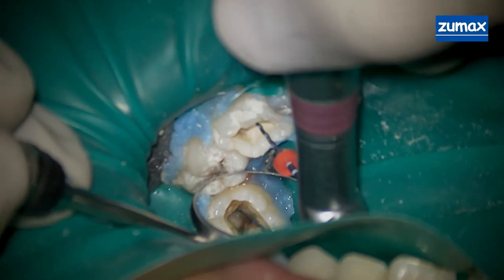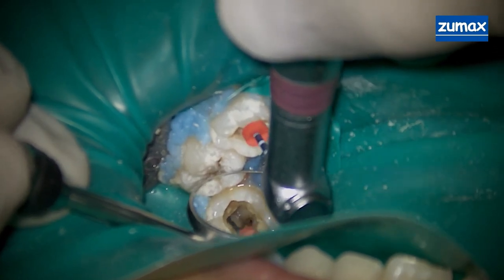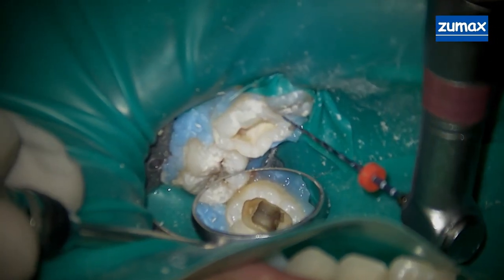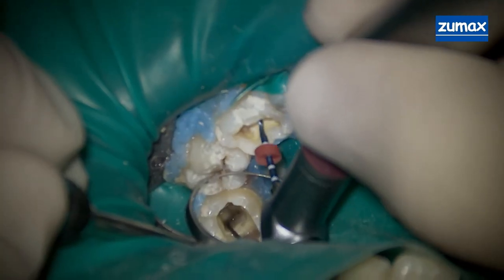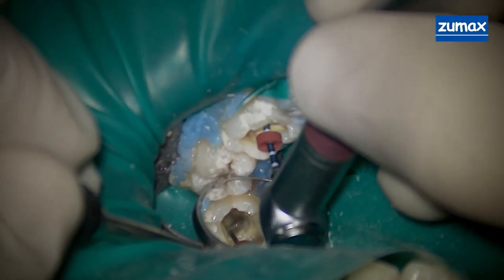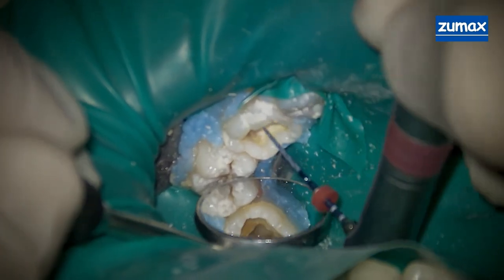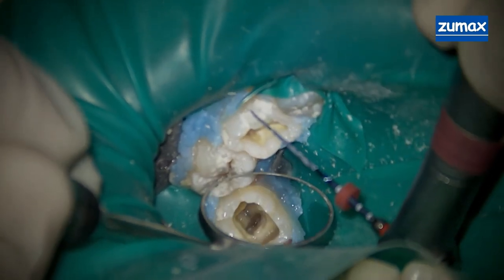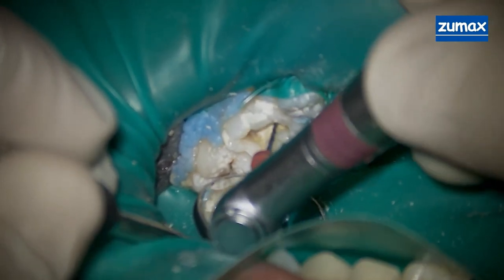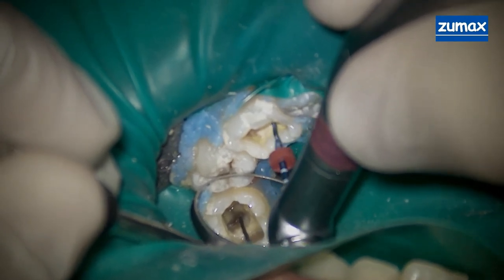Notice the pecking motion as we're cleaning and shaping these canals. It's not a motion where you just force the file in — it's pecking. You're going to feel it pull and then you pull back. This helps ensure that you're not going to separate files and that you're not going to be transporting the canals, essentially changing the shape of the anatomy.